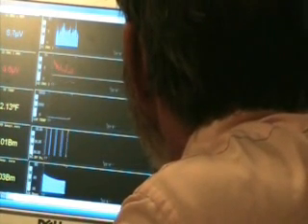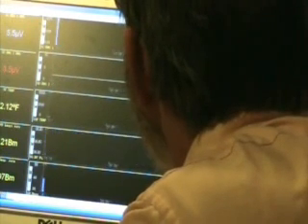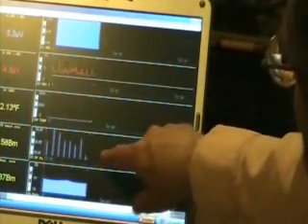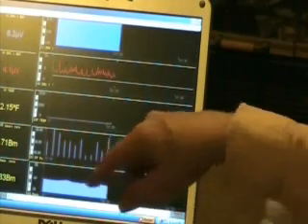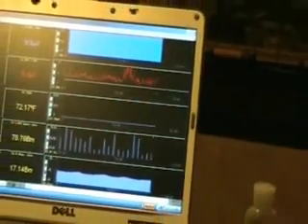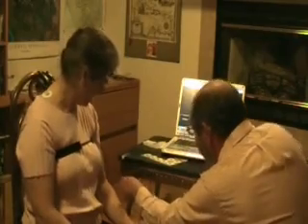And we're going to want to see whether we're getting a nice regular beat. This is not set up to pick up what the heartbeat looks like. It's not the shape of the heartbeat, okay? It's just so that we see that the heart is beating regularly. That's all we care about, that we're picking up the beat. We can't tell whether this is normal or not, and we are getting a good signal. I guess I shouldn't sound so shocked. Every once in a while it happens, you get a good recording.